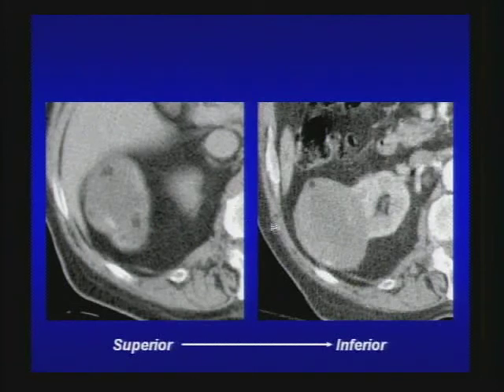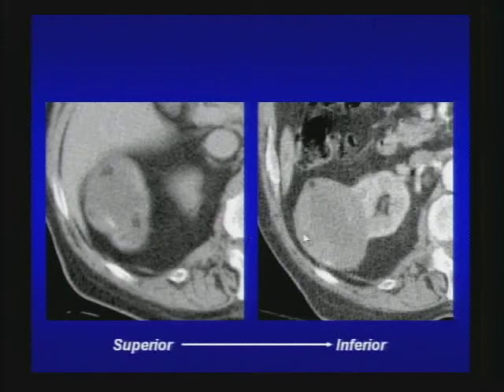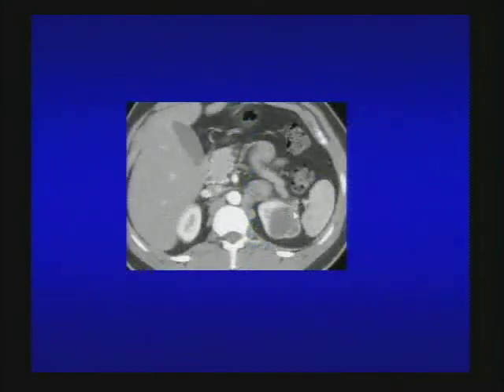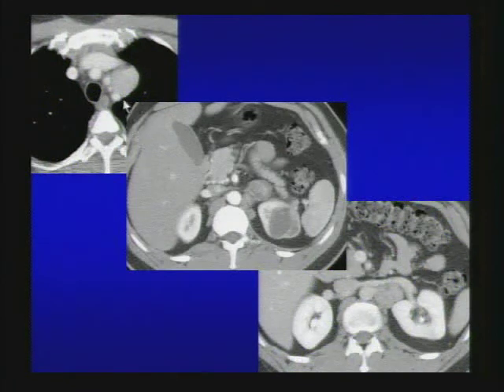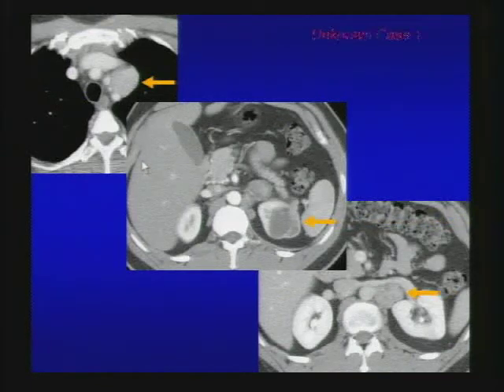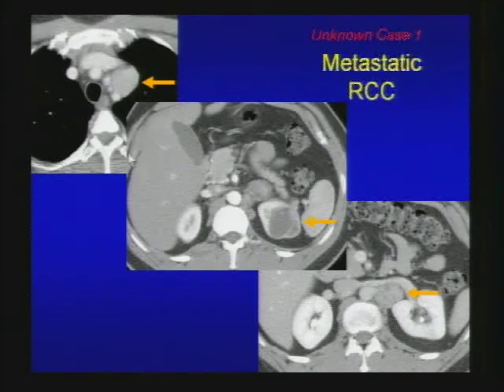Another practice case: a predominantly solid mass from the right kidney with a few dots of fat — you're not going to mistake this for angiomyolipoma. This is a predominantly solid enhancing mass — renal cell carcinoma until proven otherwise, fat-containing RCC. Here's a predominantly cystic lesion with solid enhancing component — looks like cystic RCC. But look for other findings: there's prevascular lymphadenopathy, a distant lymph node — this is a case of distant metastatic renal cell carcinoma. This is the answer to unknown case number one.